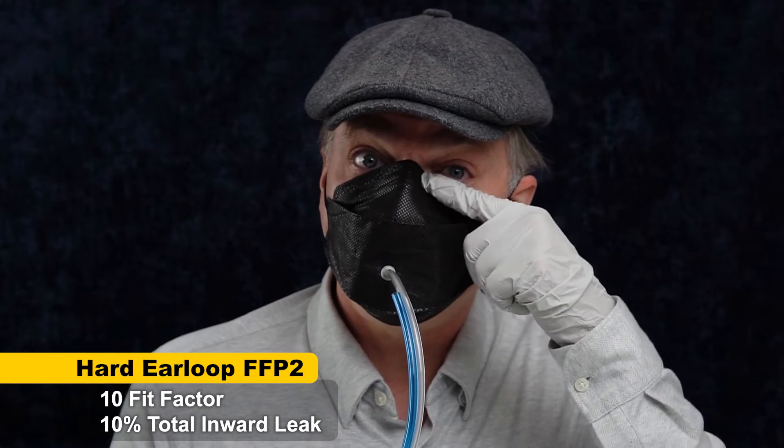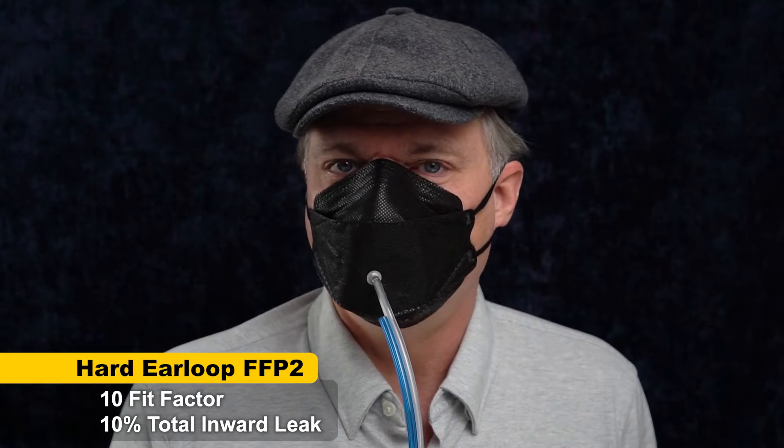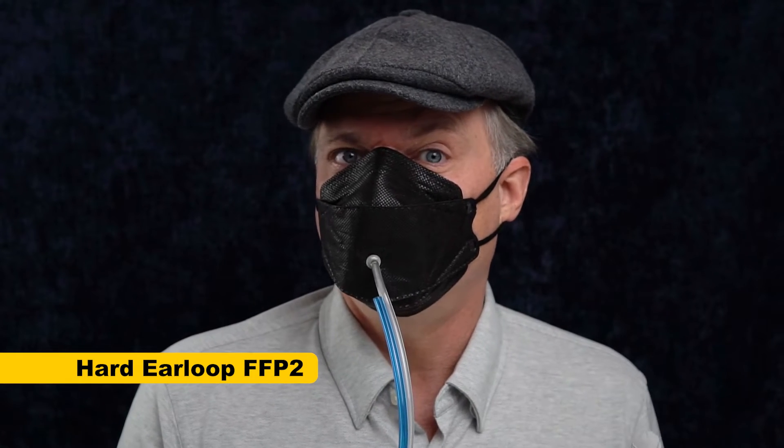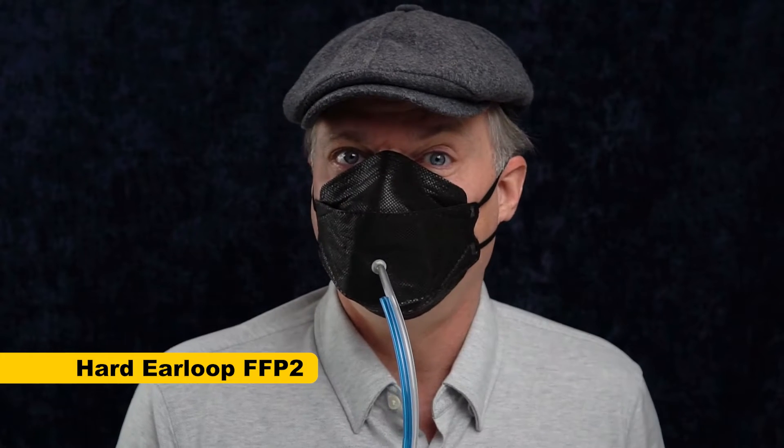Also, this mask rides high up into my lower eyelid — that's not comfortable. So I think there are other masks that I prefer to wear. You still do get some protection with a fit factor of 10, and you might get much better results because you might not have the same nose bridge I have.